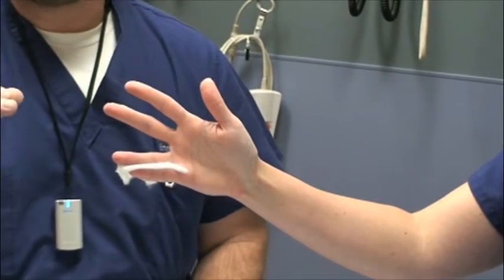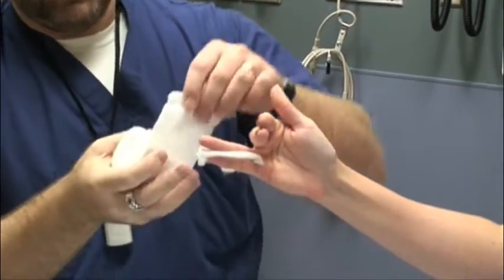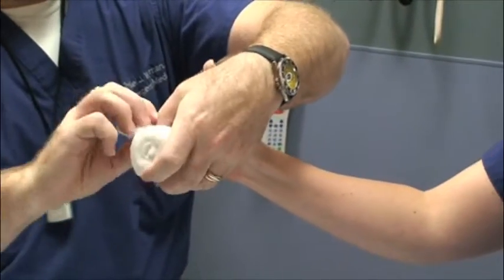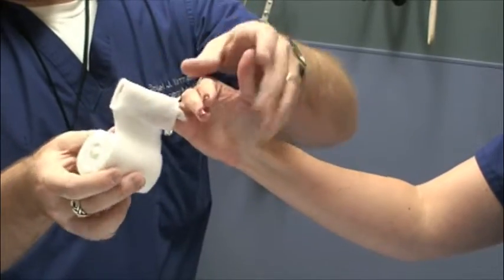Sometimes I ask the patient if they can either bend their hand this way so I can easily wrap, or if they're really coordinated, bend their hand the other way so I can easily wrap. Sometimes you just kind of force your way around.